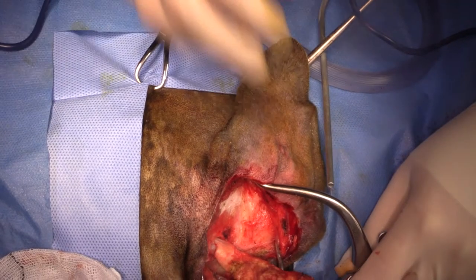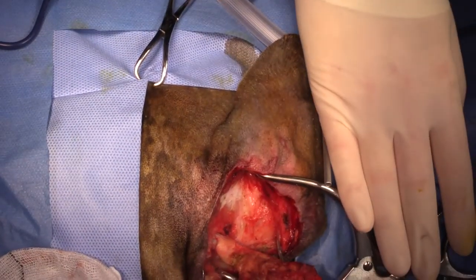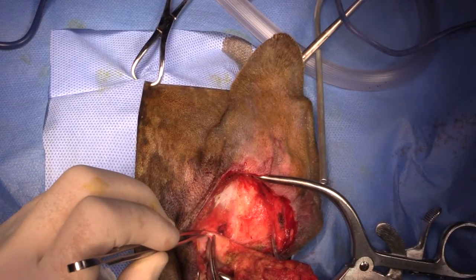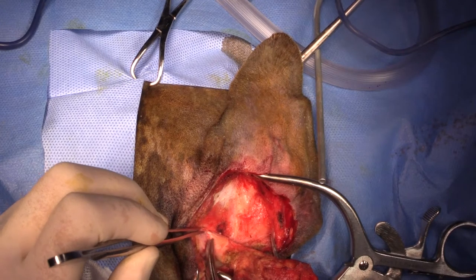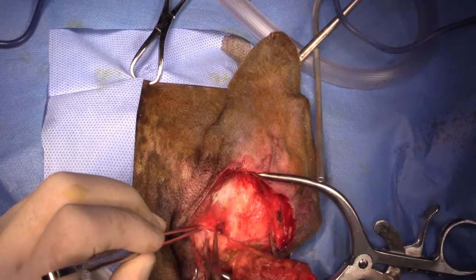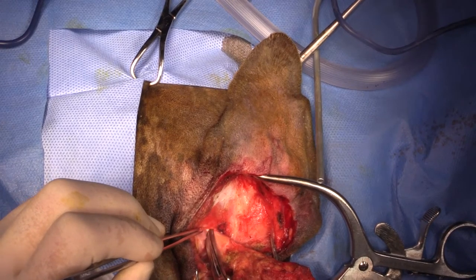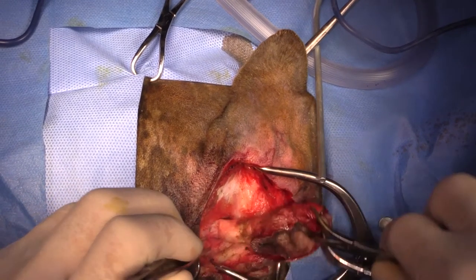Just pull caudally on that one. Thank you. I'm just being really careful to stay right on that auricular cartilage there.